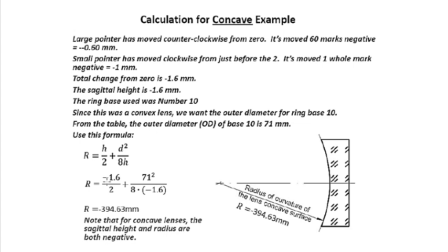Do not forget your minus, yes, and then your D, your diameter, is going to give you 71 to the power 2, which is your square. Do not forget you get this D from a sheet. Then you plug it in and do your Excel, and it's going to give you 394.63. So let's check if we're getting the correct one.